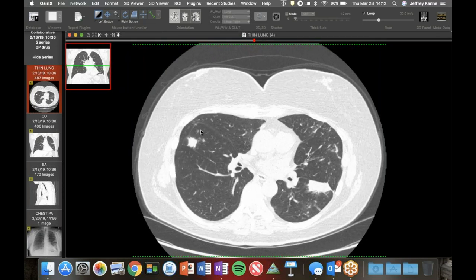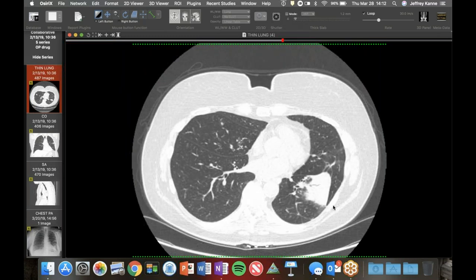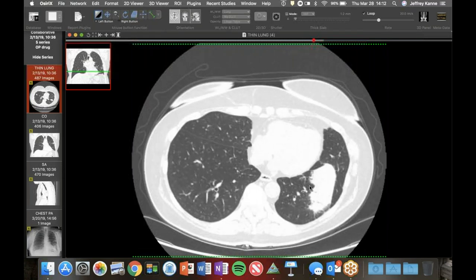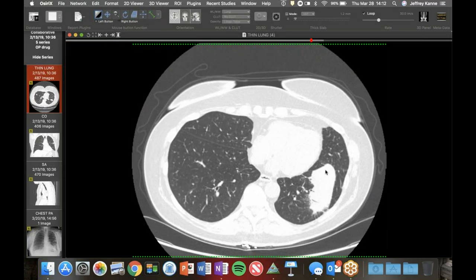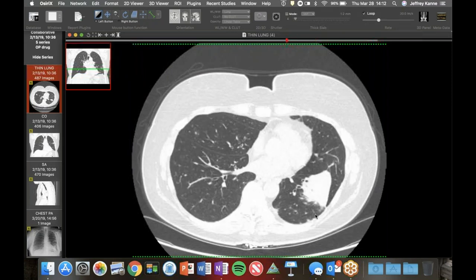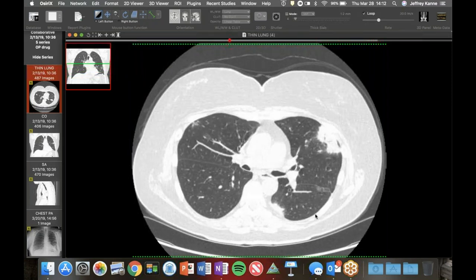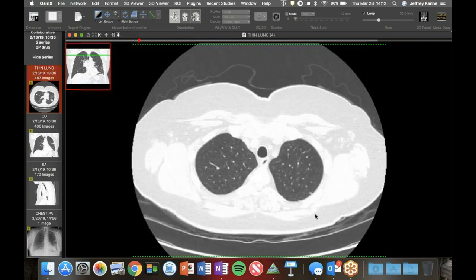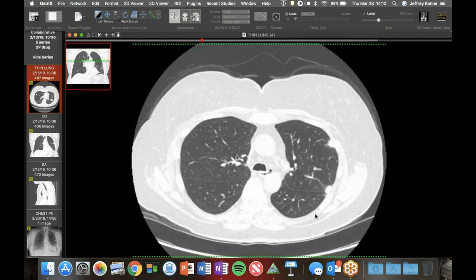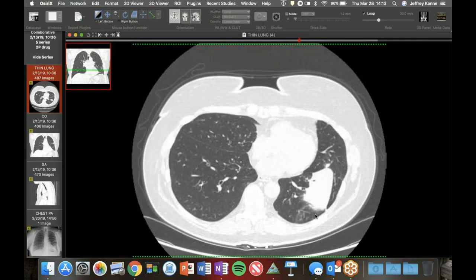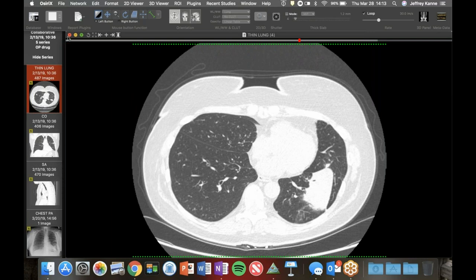Many of them have air bronchograms - they're very discrete with sharp margins, and they cross bronchovascular segments. You've got three different airways coming in and it's this confluent mass. This is a nice look for an organizing pneumonia pattern. Daptomycin seems to cause a lot of organizing pneumonia - it's one of the more common antibiotics to give you a lung reaction. With treatment, it gets better just by stopping the drug, though some patients require steroids.